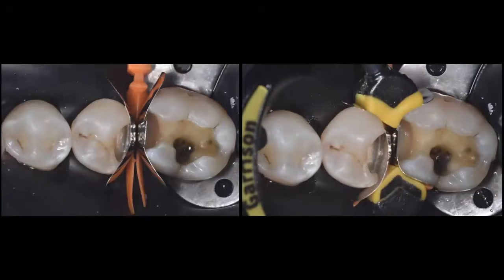These are the stiff Garrison bands. Again, I'm choosing to use the stiff ones because this is a wide interproximal preparation, a deep preparation, but also there's a back-to-back component. So you have a really wide space that you need to restore.